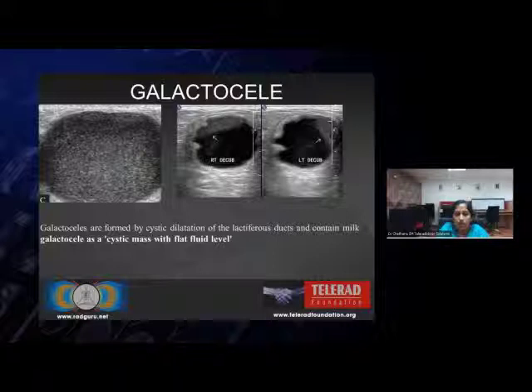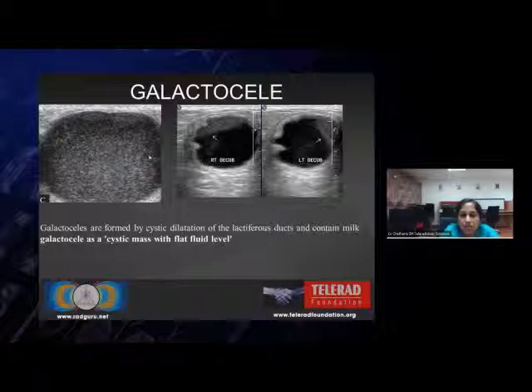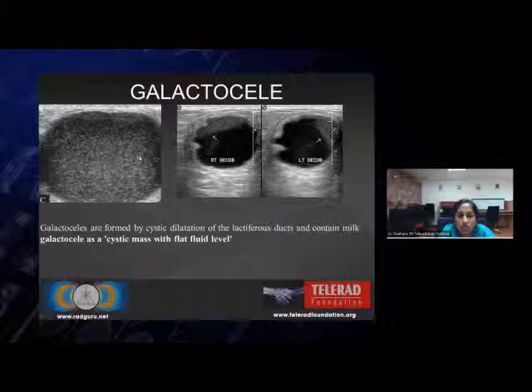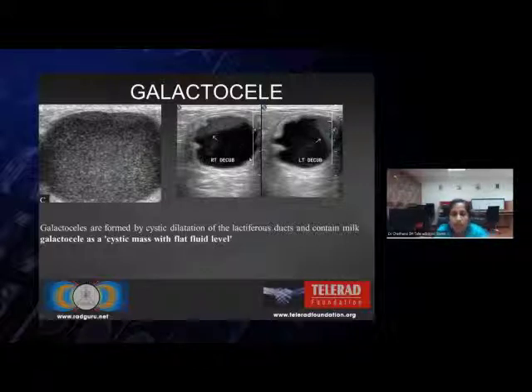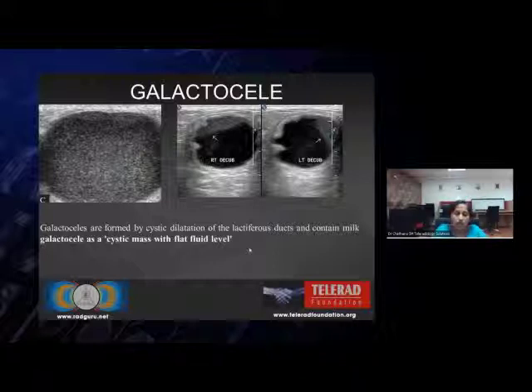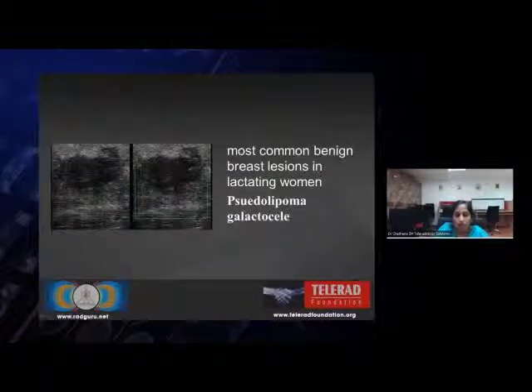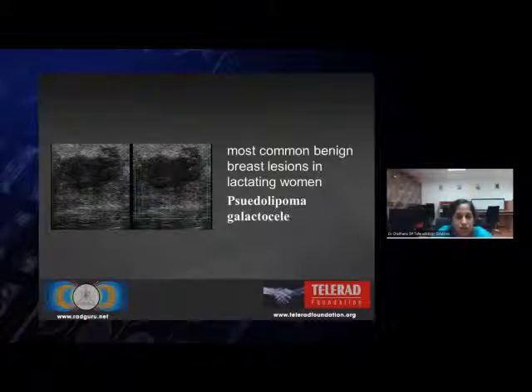The next most common lesion in the lactating woman is the galactocele. Galactocele presents in various forms. The most common ones are a well-defined cyst with homogeneous internal echoes or sometimes with a fat-fluid level which changes with position. These galactoceles are basically formed due to cystic dilatation of the lactiferous ducts and they contain milk. Sometimes it can present as a solid hypoechoic mass with ill-defined margins without or with minimal color flow, which can misguide us to think in terms of malignancy.